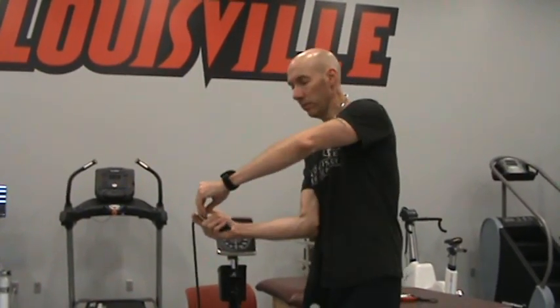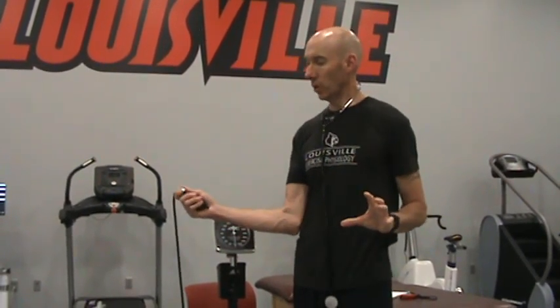A couple key errors that students often make is they'll use the off hand to tighten this valve. Well, once you start taking the blood pressure, this hand's gonna be busy, and it's then harder or more difficult to open the valve with these two fingers. So we wanna close with these two fingers, open with these two fingers as well.